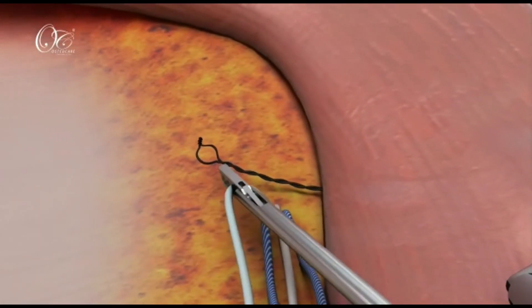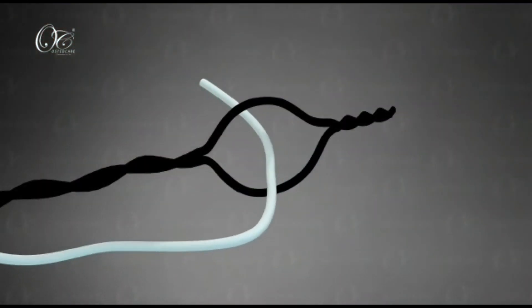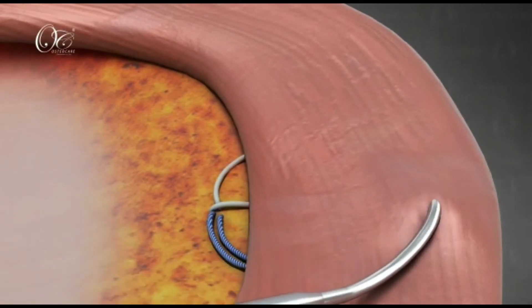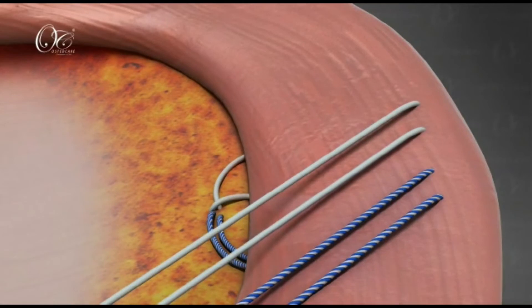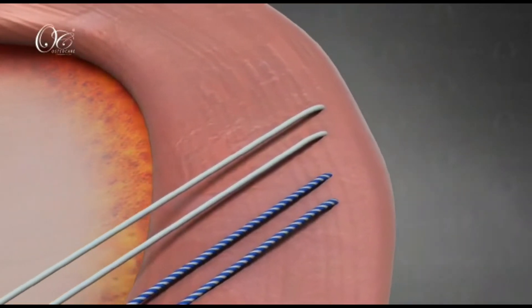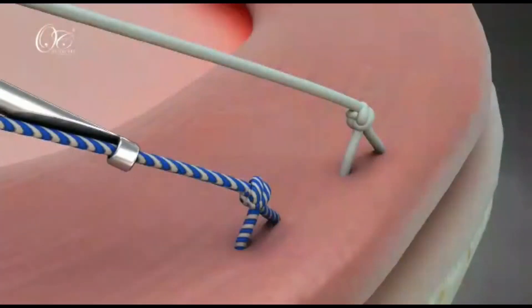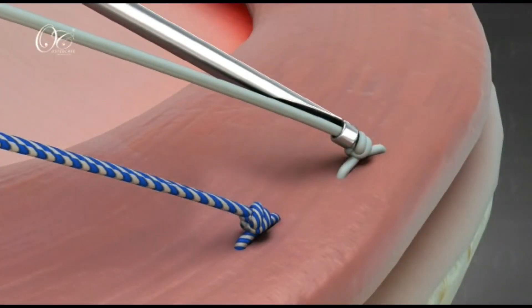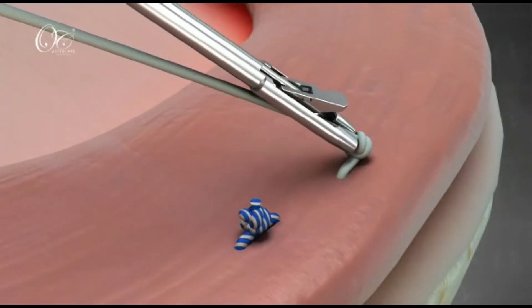We can use our curved suture passes to pass the suture sequentially through the meniscus tissue. This is usually in the vicinity of the meniscotibial junction or the meniscotibial ligament. Once all the sutures are passed, they are tied together, thereby reducing the meniscus onto the anteromedial aspect of the tibia.